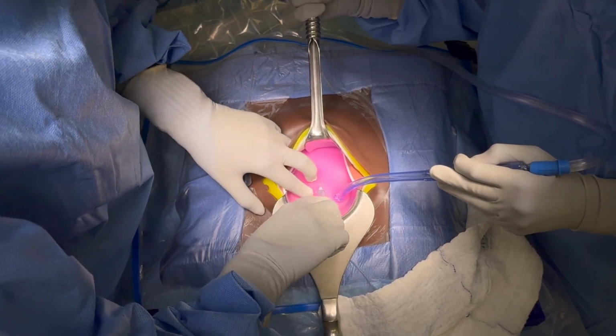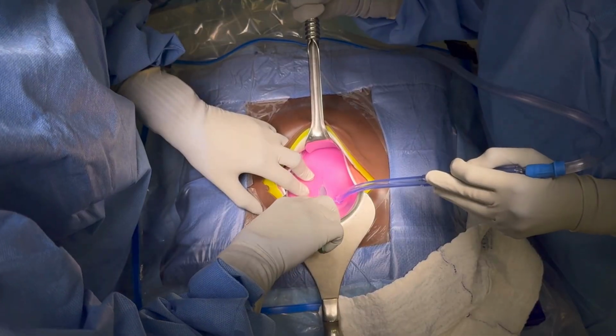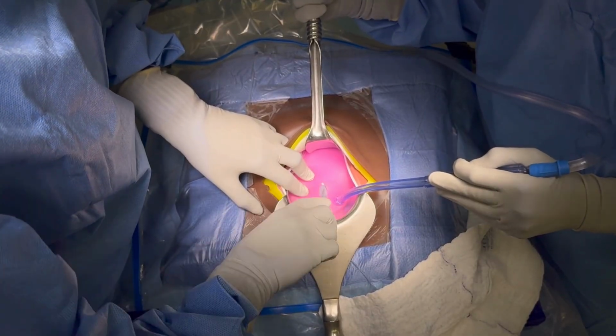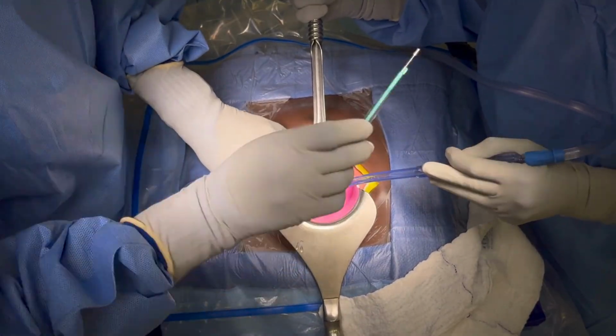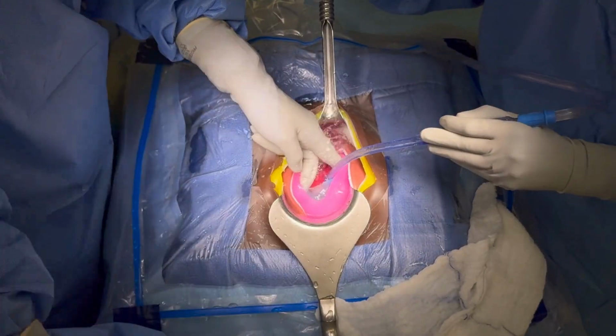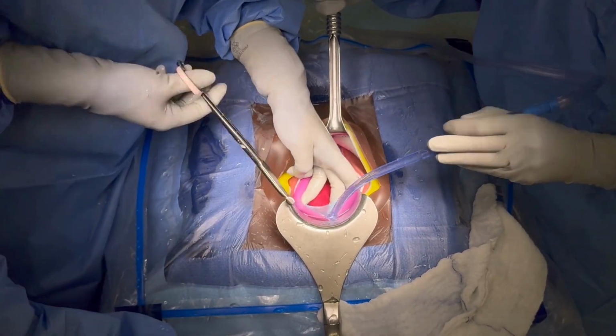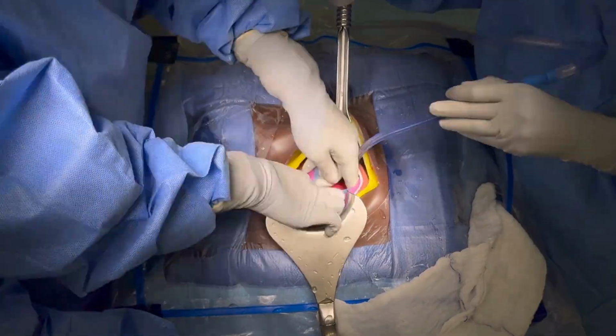Once the uterine cavity is entered with a scalpel, the surgeon inserts 2 fingers through the hysterotomy site in order to create a plane between the fetus and myometrium, and bandage scissors are then used to extend the uterine hysterotomy, both cephalad and caudad if necessary, to facilitate delivery of both the fetus and the placenta.